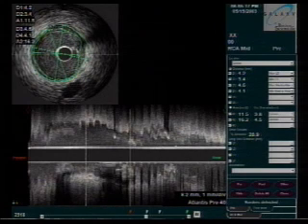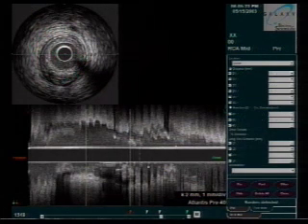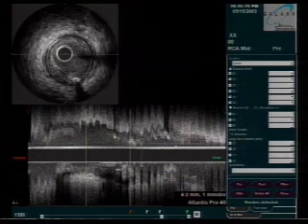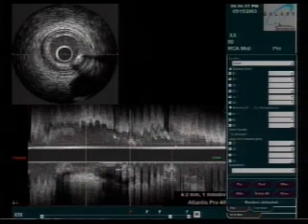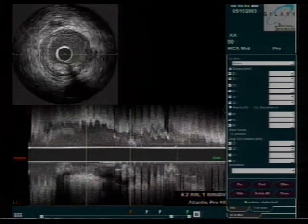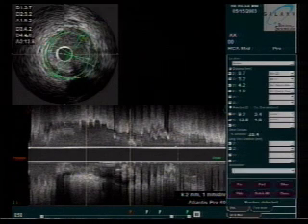We'll save those measurements and move downstream to again an area that is free of atherosclerosis, because as Dr. Campbell mentioned, we no longer want to minimize the length of stent, but what we want to do is go from healthy vessel to healthy vessel, because there's a little bit of trauma at the edge of the stent, and if there is some trauma in an area outside the stent where there's no drug, we could potentially have some re-narrowing there. And since the risk of narrowing inside the stent is so low, we want to make sure we have no edge trauma to deal with. So now we're going to make some measurements at the distal aspect, and we see again it's about a full 4 millimeter artery.